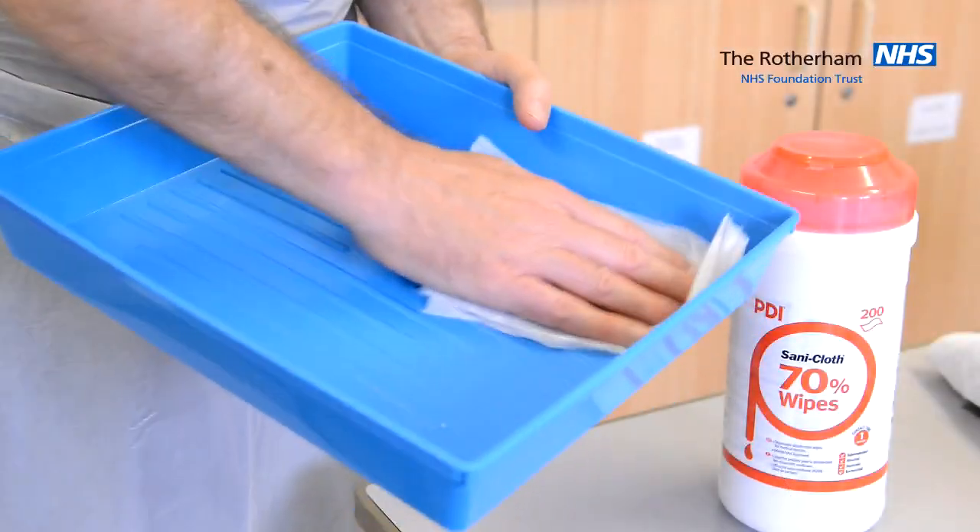It is not the purpose of this short video to teach the whole skill of how to take a blood culture. It is to focus on how to prevent contamination.